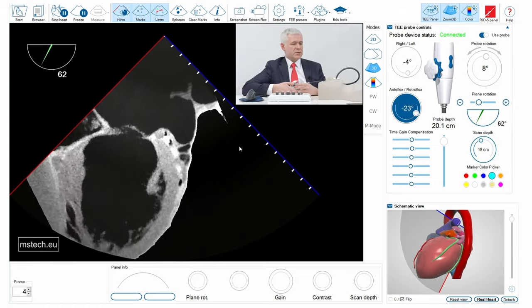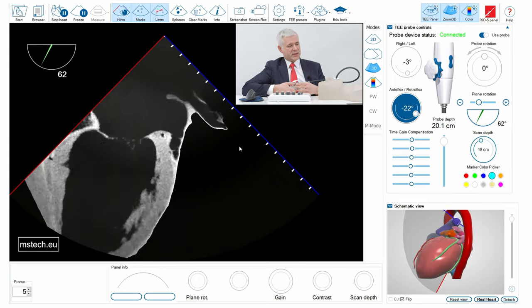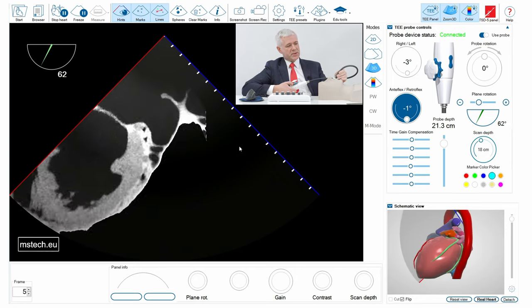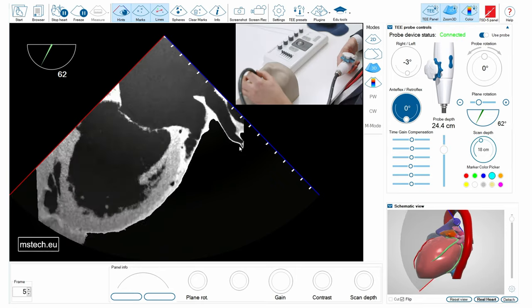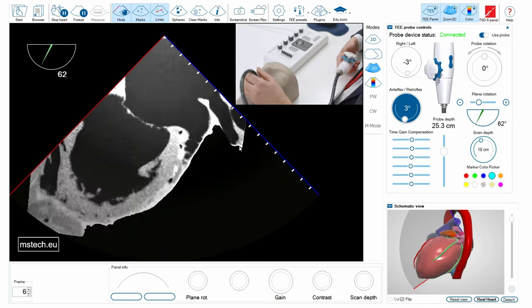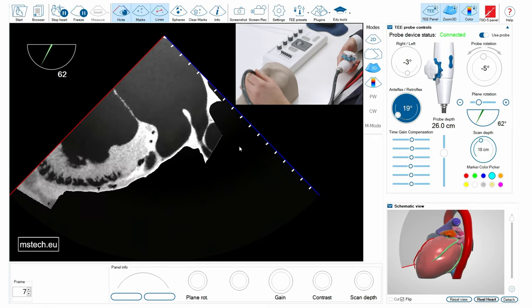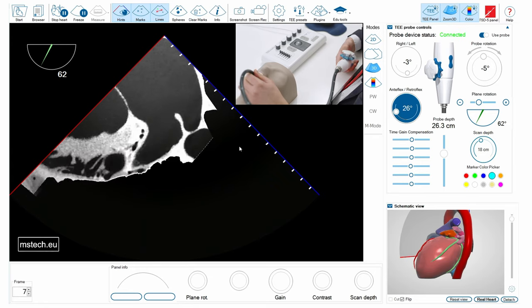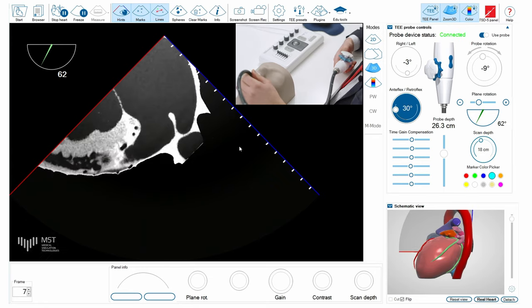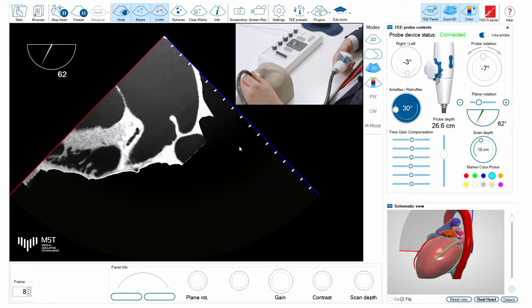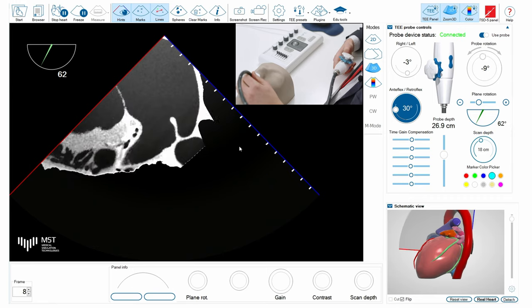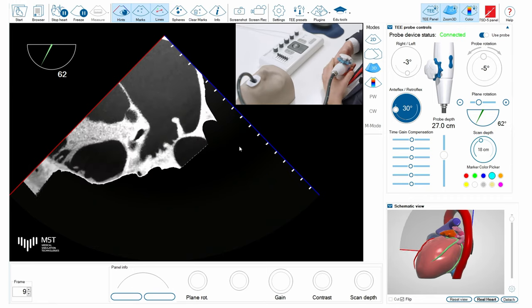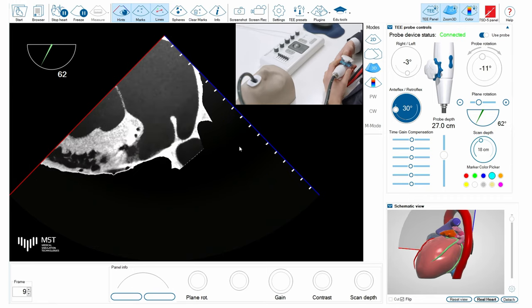So it's important to understand that in order to scan it properly we have to insert the probe deeper, closer to the transgastric views, and then change the angle of the tip of the device and position the left atrial appendage in the center of the screen.